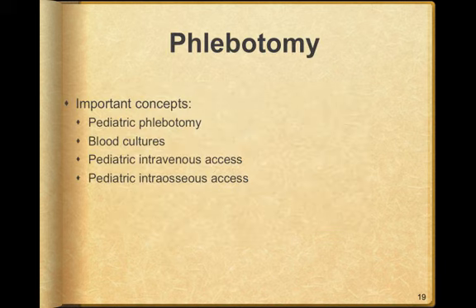Phlebotomy. Important concepts. The pediatric phlebotomy, very simply, a kid, you have smaller veins. Blood cultures, when the patient has a fever, the paramedic may be drawing blood cultures. Most of the hospitals are now on a type of sepsis protocol. So don't feel offended if they actually redraw the blood cultures, but they have to be done in a specific fashion to fit within their sepsis protocol.